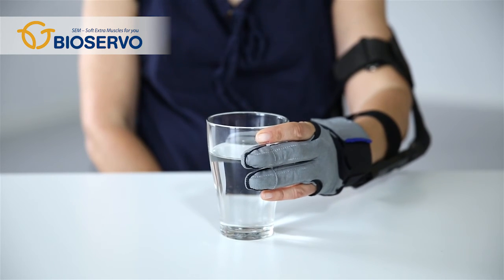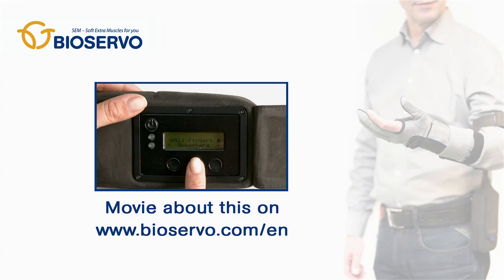When you release the object, the SEM glove's power releases and the motors silence. Since the SEM glove is designed to fit a variety of people with different conditions, there is a possibility to make various settings optimal for you.